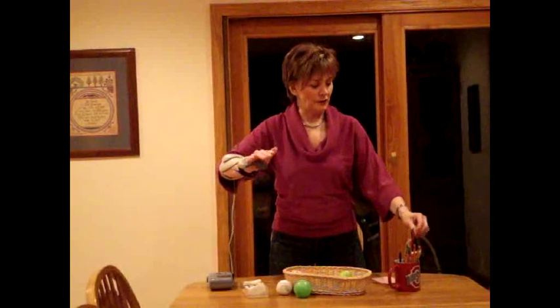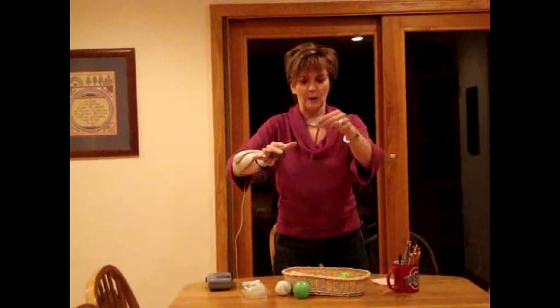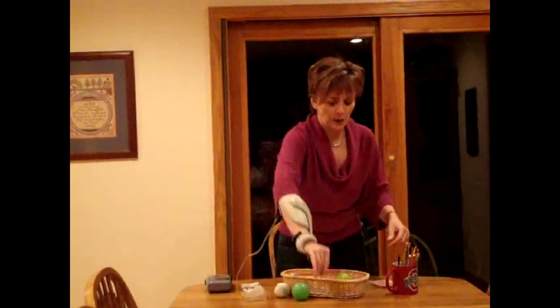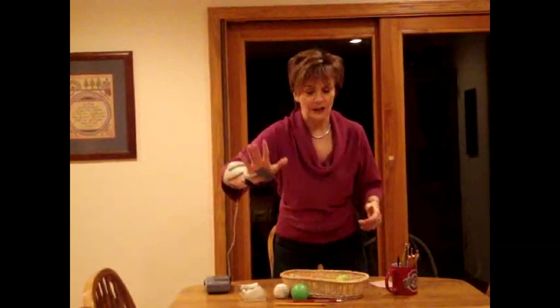I also then took some pens and pencils that I couldn't pick up necessarily with my fingers because they weren't working that much. So I picked it up with my left hand, and then when the machine opened and closed my hand, I would hold the pencil, and I would reach out and put it down. And I was opening up my hand again, and I would take the pencil, try to work on that pincher grasp or grip, and then when it opened up my hand, I would lay it down.